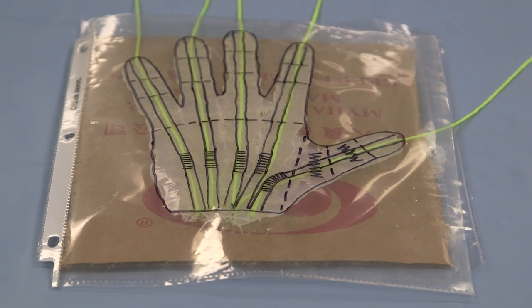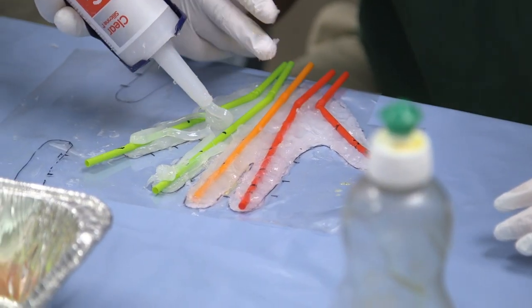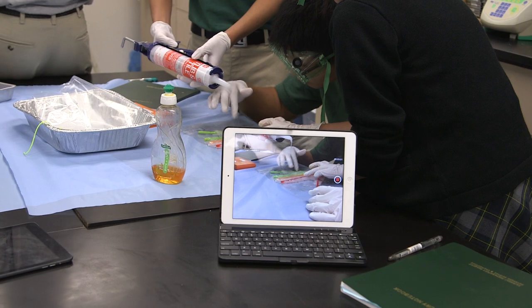After we received our materials in lab, we had to figure out what we were doing because there was no procedure. First, we started out with a page protector — we traced our hand on it to use for the model. Then we learned to use a caulking gun to place the mold and the outline of the hand in silicone.